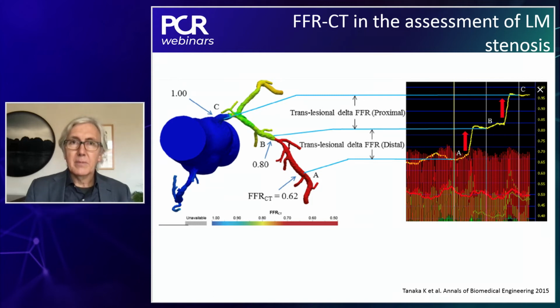Javier, can I ask you two questions which are really relevant to this part of our webinar? Dr. Emad Abdelhey is asking, what is your last update in evaluation of ostial circumflex subtotal lesion, Medina 001, in your cath lab? What is the sequence of decision-making and strategy planning?